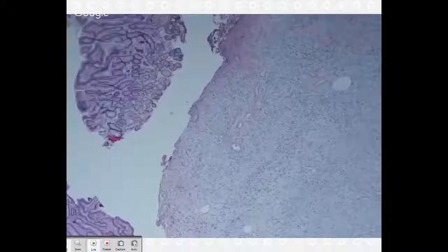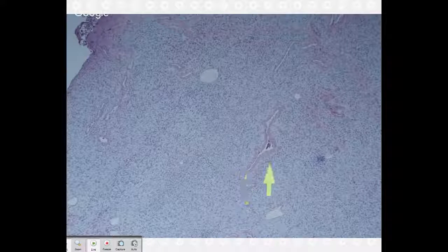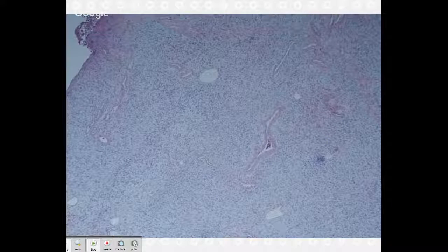So diagnostic things, besides being pale and having that loose edematous stroma, as Emilio pointed out, we have these vessels. People often talk about onion skinning around vessels. If I squint, maybe I could pretend there's some onion skinning in this one, but there's really not good onion skinning in this example. But the vessels are prominent. They do stick out at you, in part because the surrounding stroma is so edematous that the smooth muscle of the vessel walls is actually dark.